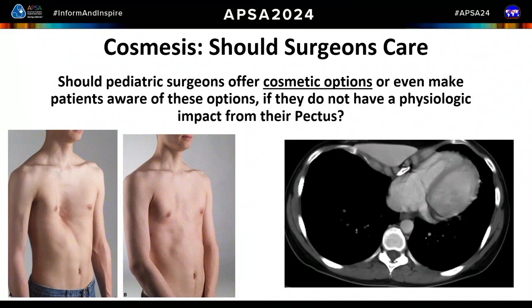And to the prior comment about patient self-image and age, that's so important, because we have a number of families who come and see us, and the parents want the vacuum bell, and the kid's 9 and they don't care. And the concept of assent for a child is so important for this, because this is not something that we want to send a parent chasing their child around the house wearing a vacuum bell every day. So anyways, those are my comments.